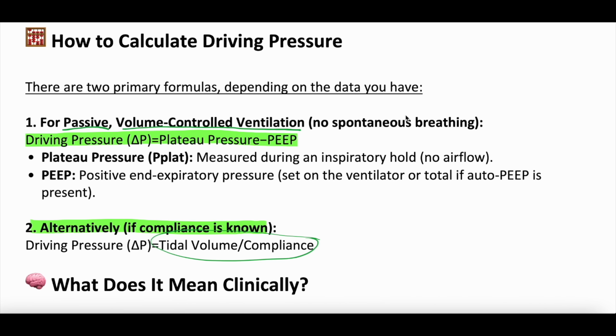And what you have to do is you have to get a plateau pressure. If you do not know what a plateau pressure is, this video is probably a little beyond where you're at. We have a whole playlist on all things mechanical ventilation where we dive into plateau pressure. It's linked in this episode's description, so definitely check that out and then return to this. For those of you who do know what a plateau pressure is, friendly little reminder, you have to get a plateau pressure with an inspiratory hold.